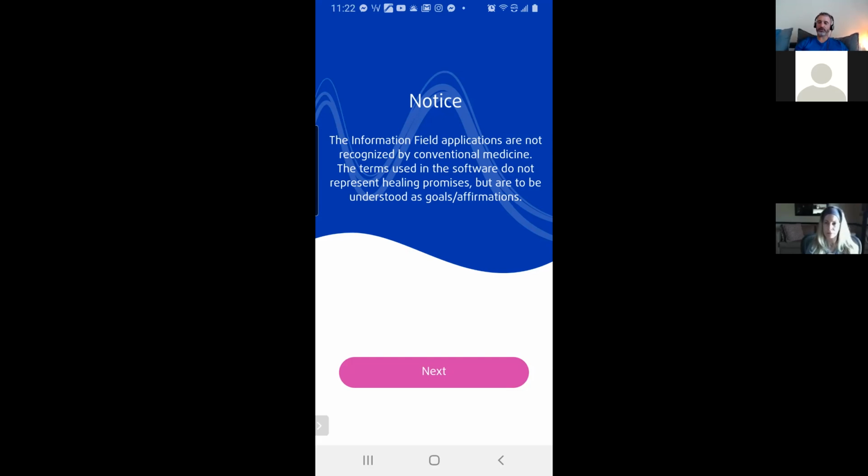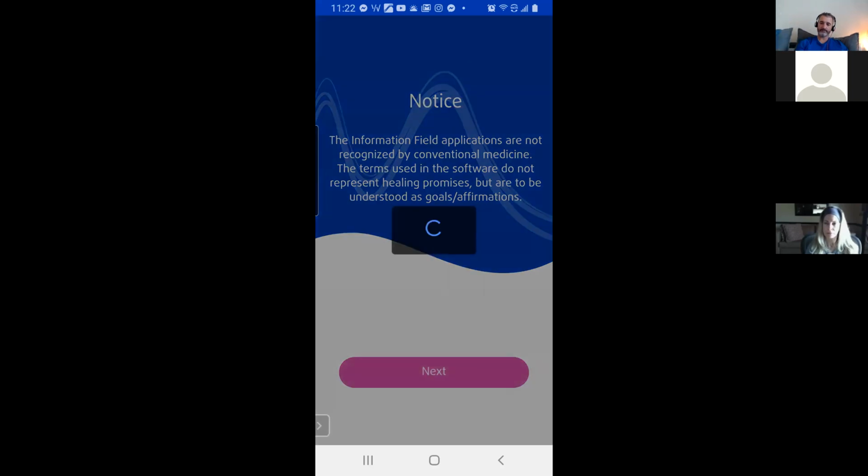So first I've got to make sure that this device is on, and I'm going to hit next. We'll connect to it. And like I said, I can do everything with my resonance, running it while it's actually plugged in as well.